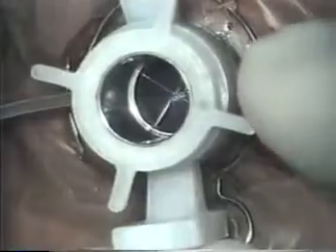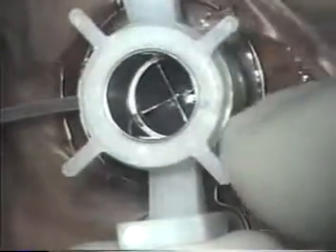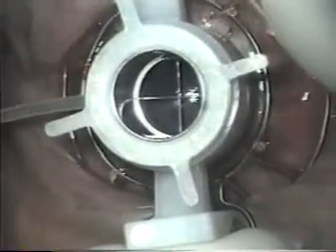The trephine is stabilized by gently holding the struts and the cornea is cut by turning the spokes clockwise. The initial three spokes turned lower the blade to the zero position. The number of spokes to turn further depends on the desired depth of cut and the corneal thickness. It is recommended that the cornea be cut as close to Descemet's membrane as possible.